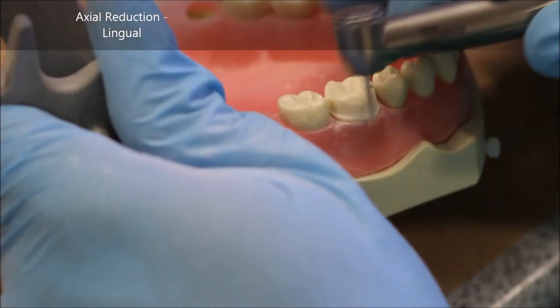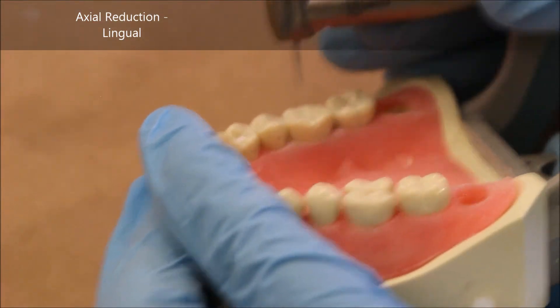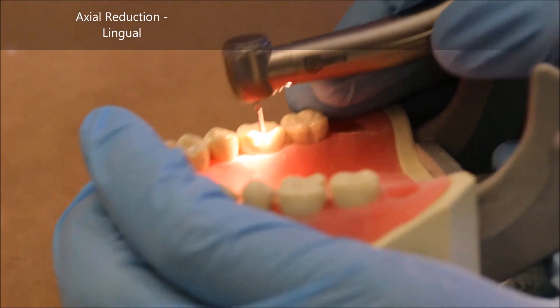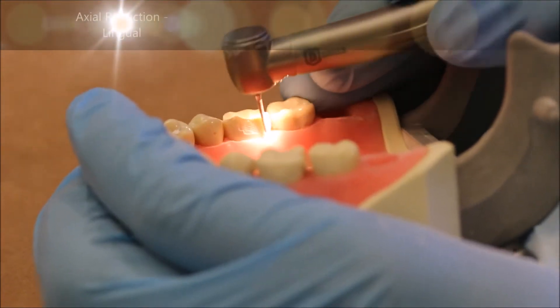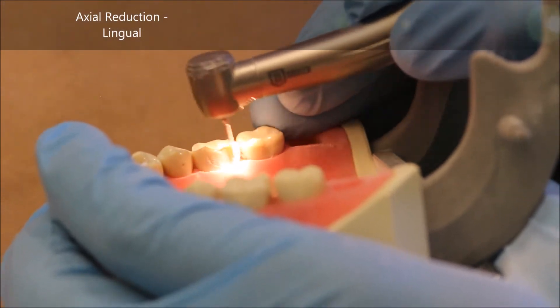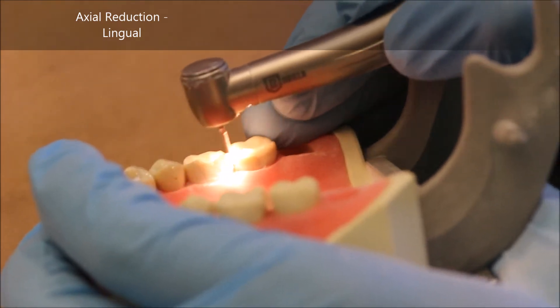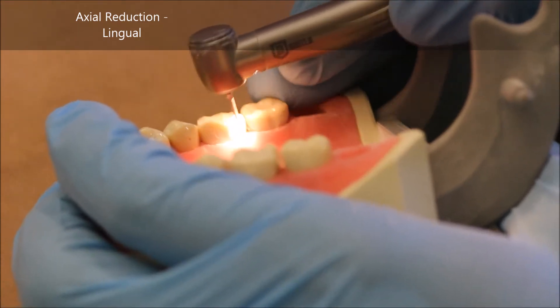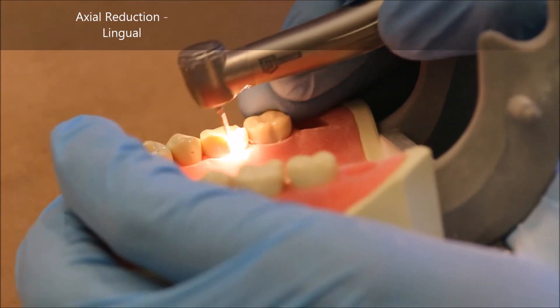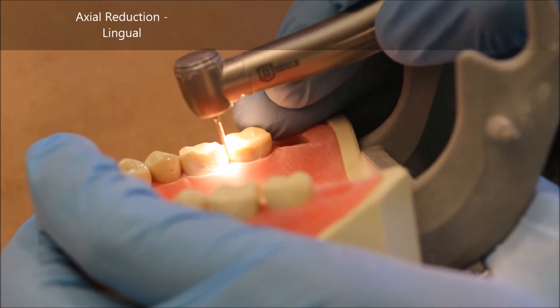If the walls of your preparation do not converge, the crown that you make will not fit. Having checked my draw, I begin prepping the lingual surface. It's the same general motion — you place it such that you have at least three millimeters of axial wall, working in large, broad, steady swings in order to keep your finish line fairly uniform all the way around the gingiva.